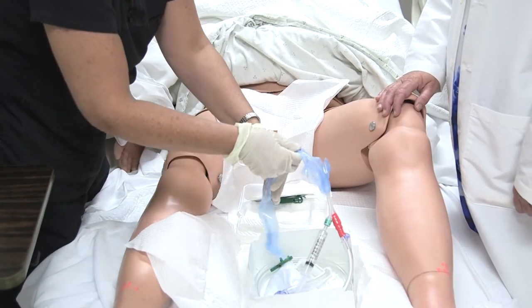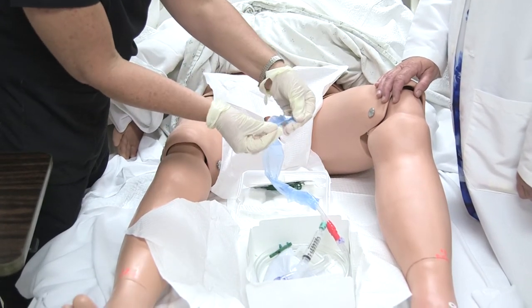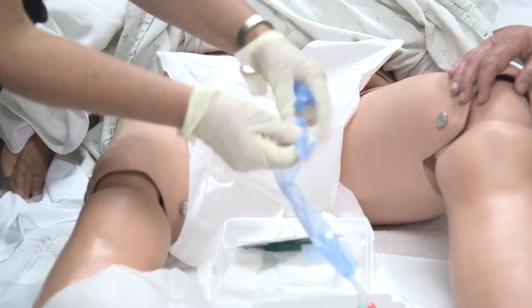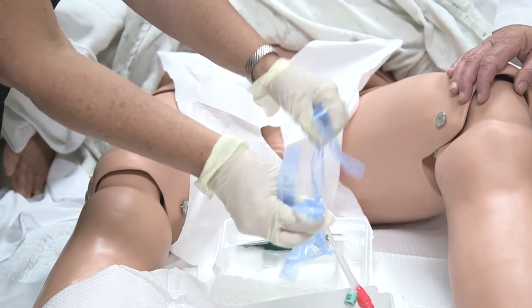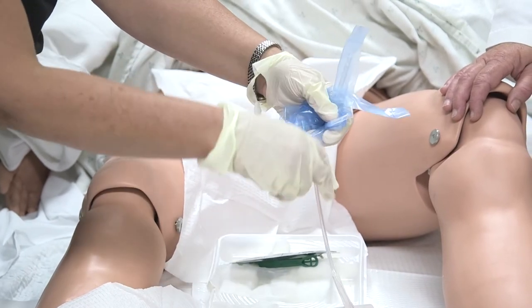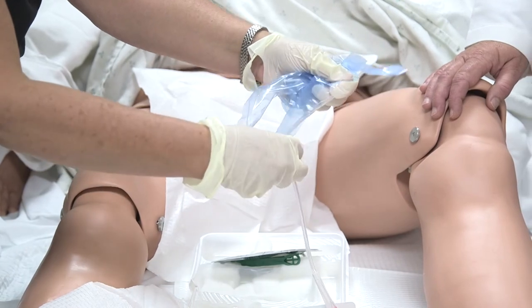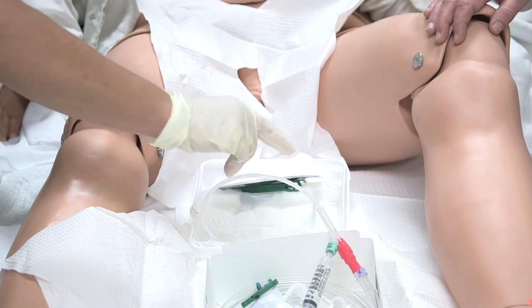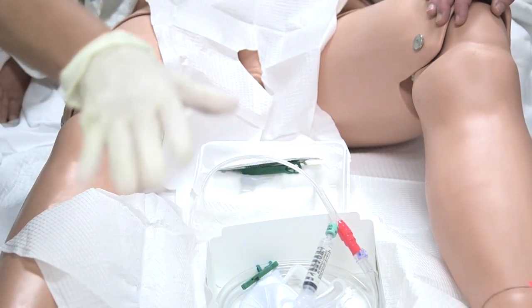Next, I'm going to take the wrapper off of my actual Foley catheter. There are perforations in here, so you can easily open it. Word of advice, just keep everything contained so you're not flying it all over the place, because that way, you decrease the risk of contaminating it. All right, so just kind of curl it up in your hand a little bit. Okay, and we're going to set that right in our tray like that so it's ready to go. And I'm still sterile, just leave that there.